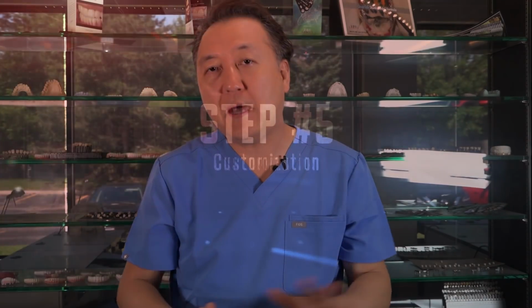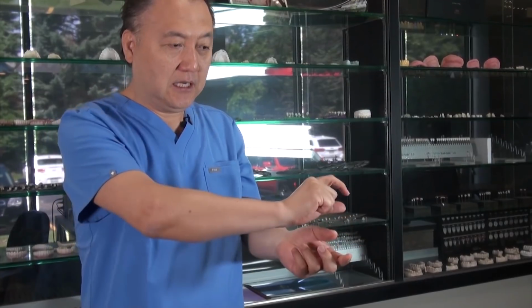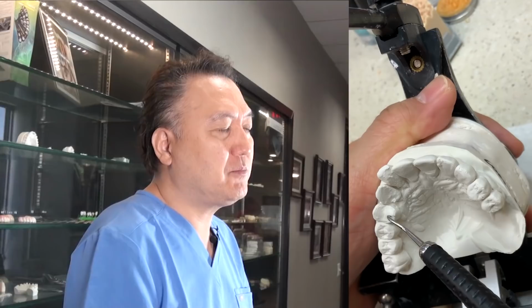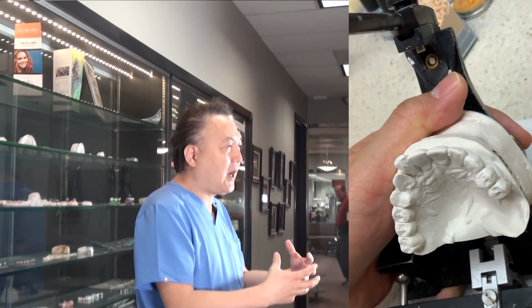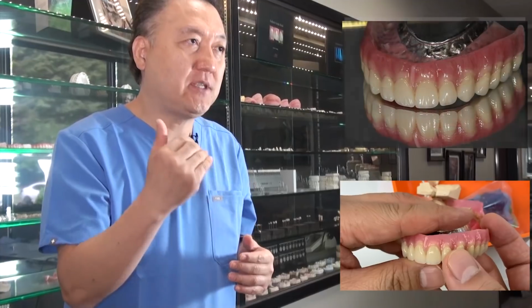Number five, I want to make good longevity. So I put in a liner, a custom one, as you can see. We wax and cast the liner, and then put full protection on the backside, which is very labor intensive and can be expensive, but I'm trying to give them the most economical way possible. Then we do the final contour with acrylic, so it's stronger. And the doctor can reline or repair when the patient is there. This is much easier.